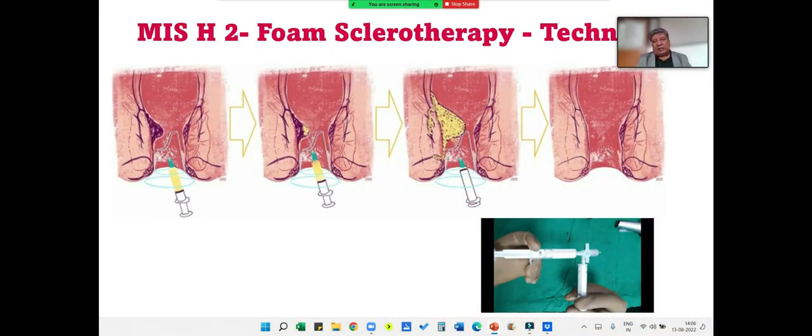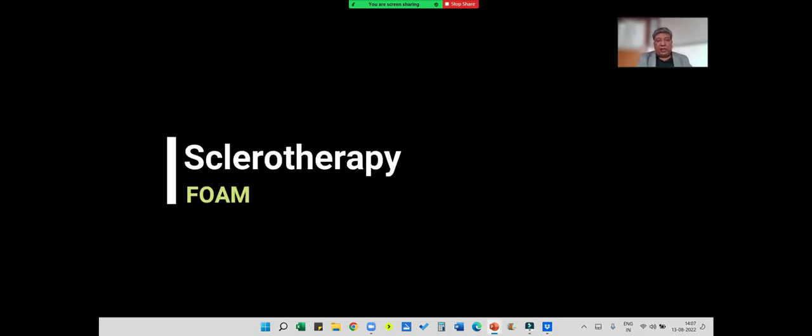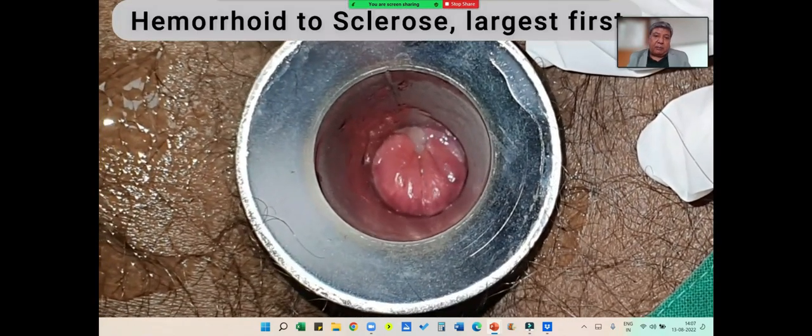The second type of minimally invasive surgery is foam sclerotherapy. Now, foam is something which has just come up in a big way. That is, polidocanol is used as a foam: 1 cc of polidocanol and 4 cc of air. When you mix with a 3-way syringe like that, it becomes a foam. You go into the hemorrhoid with this foam, you see this yellow, this is the foam. The hemorrhoids become blanched and you've got it covered. And with time, all of this becomes fibrosed. You see the normal cushion there, but here the cushion is there, but the hemorrhoids are fibrosed. So it's a really good way of doing it, and I would definitely recommend people doing it.